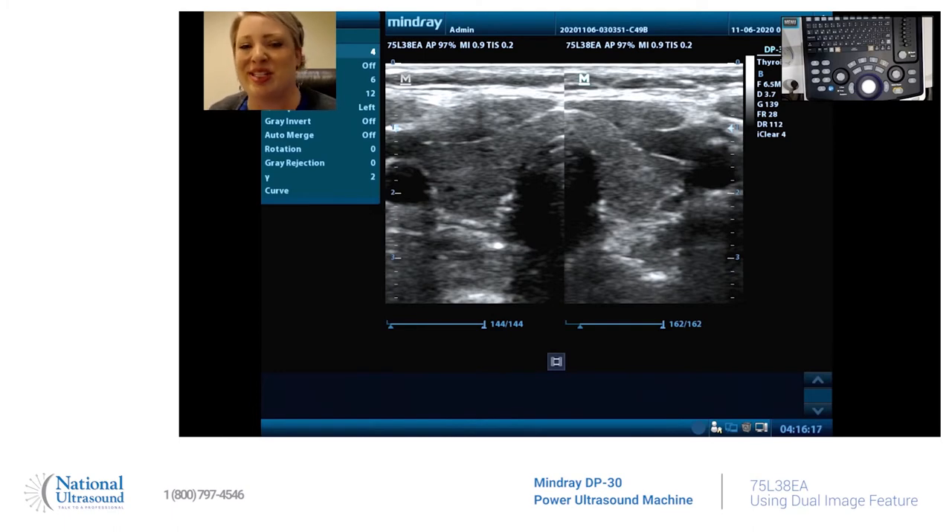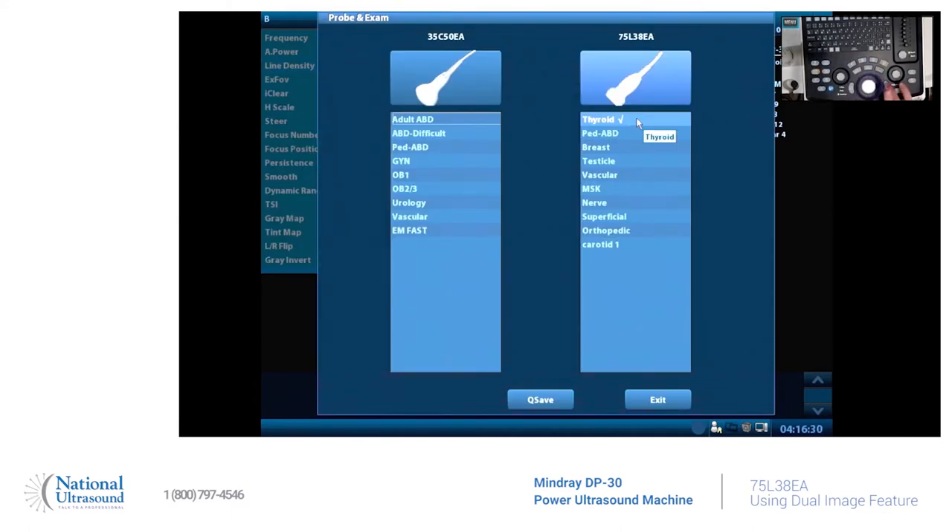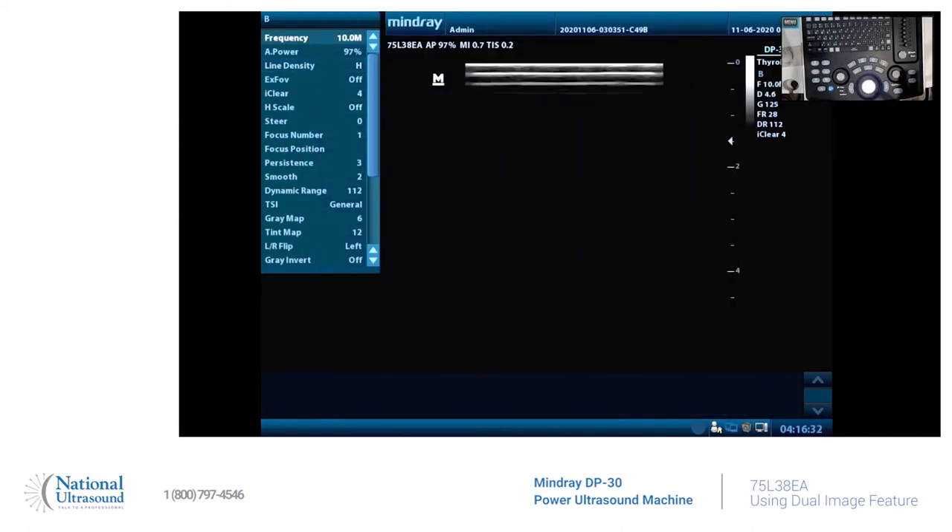So let's show you how to do it. Unfreeze. This is where you come any time that you select a probe. We're going to select probes like thyroid. This is your default settings.